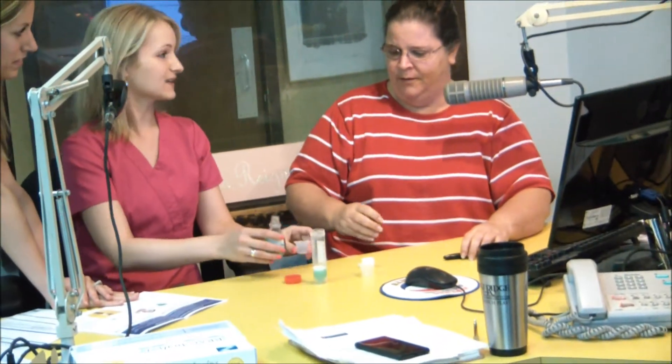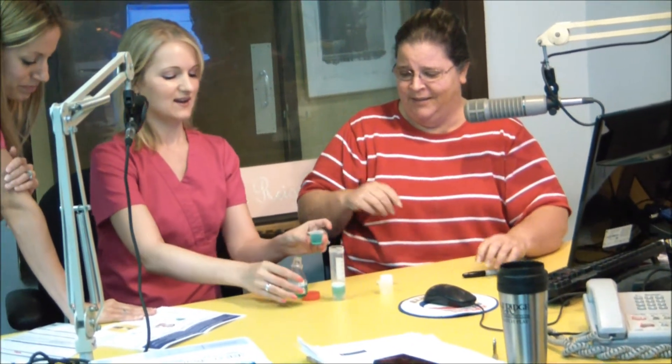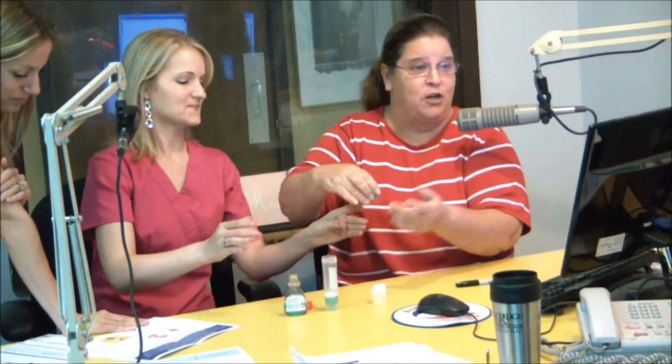We're going to do the same step again. Yay! Oh, boy. 30 more seconds? Yes, 30 more seconds. Oh wow. That's not enough. This is just for my breath.